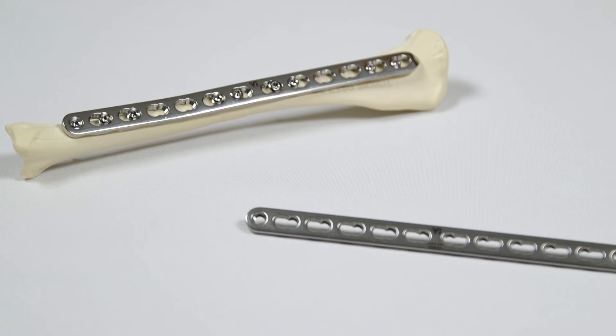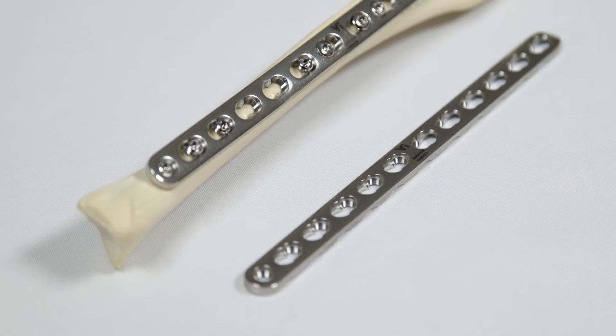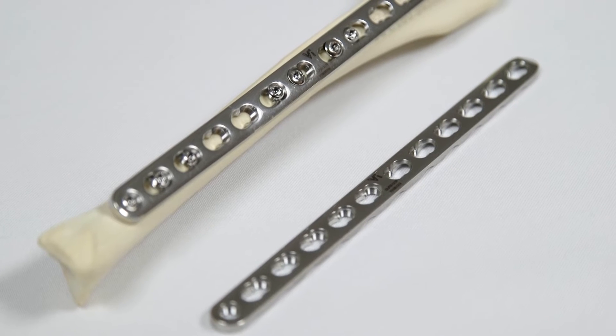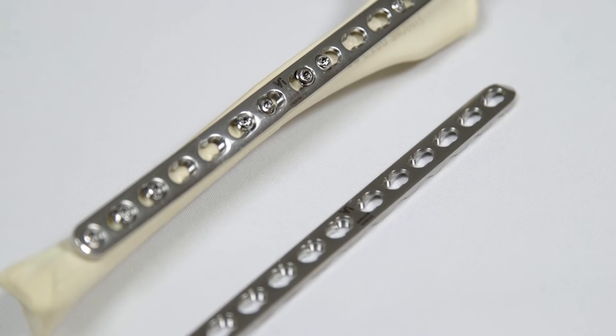The same principles apply to using a DLP in compression mode as to using a DCP — namely that the plate must be perfectly contoured to the bone and the plate must be pre-stressed. These principles are discussed in the DCP plating video.